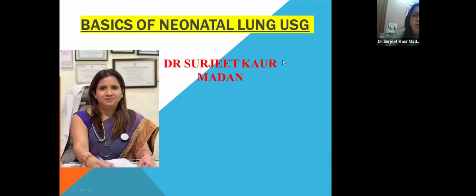Today we'll just go through a little basics of neonatal lung ultrasound.